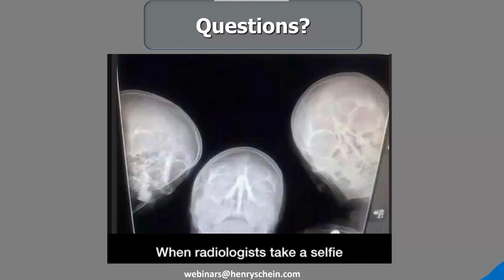What we do need to remember, though, with the extraoral bite wings is that we are still using panoramic geometry, and it's a fairly low resolution image. And so in a lot of the research we've done, many of those lesions have to be extensively large to be able to pick them up on an extraoral panoramic bite wing.